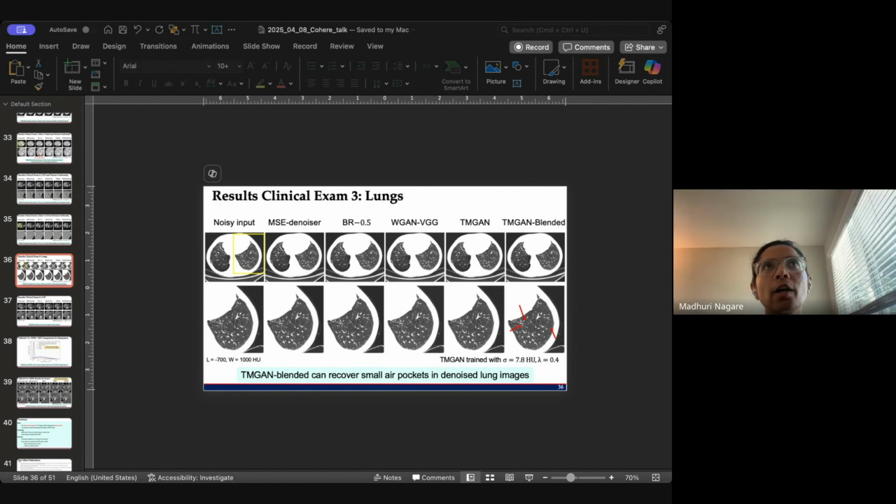So the algorithm works pretty well, but you might have noticed that the hyperparameters are quite different between the sharpening, which we basically apply for brain images, and the other denoising. So tuning of hyperparameter is challenging as organs change, so we have to calculate or determine hyperparameters in the beginning for different organs and then have them saved for the real-time application. That is a challenge for different organs.